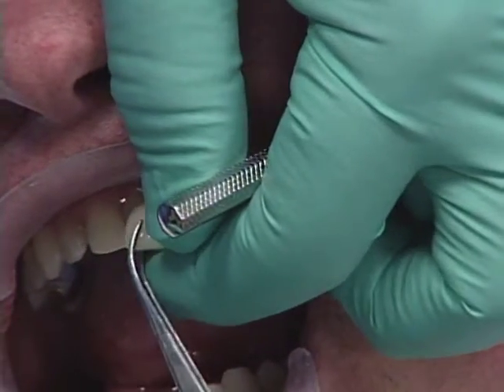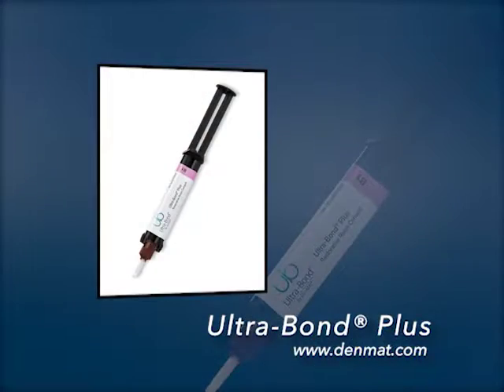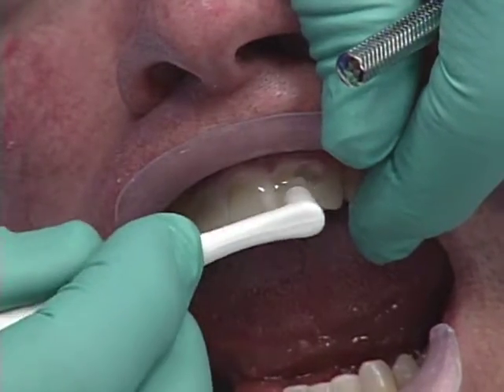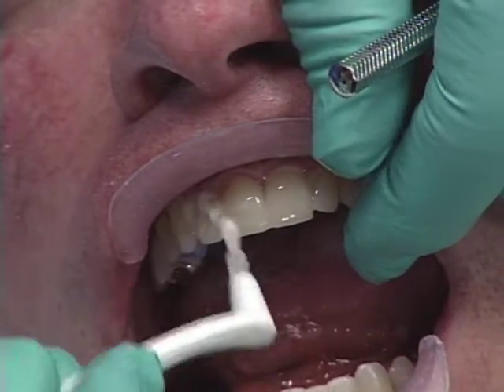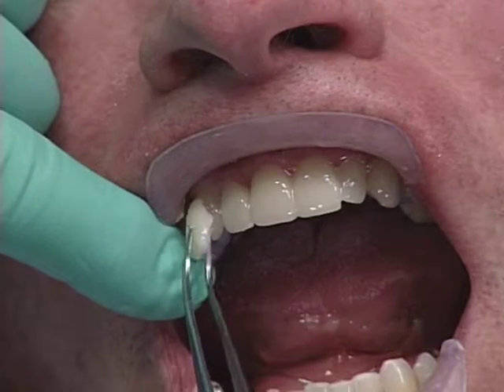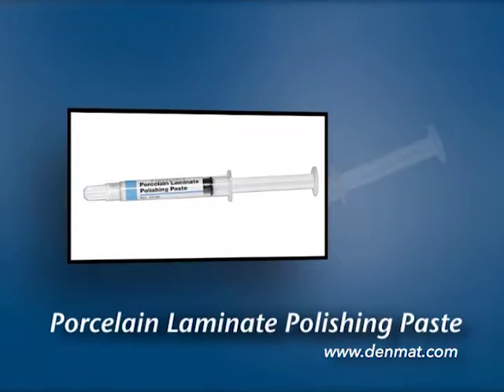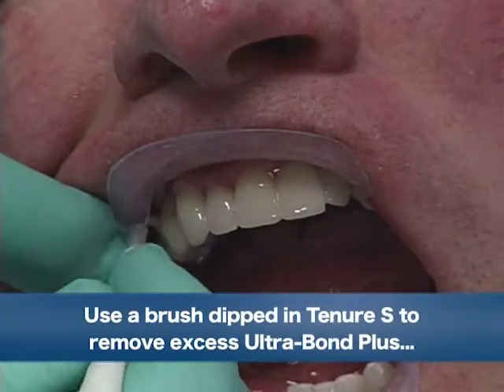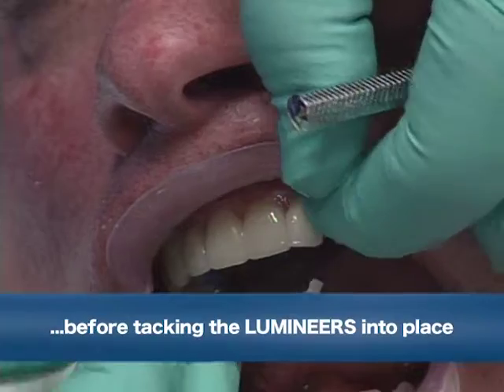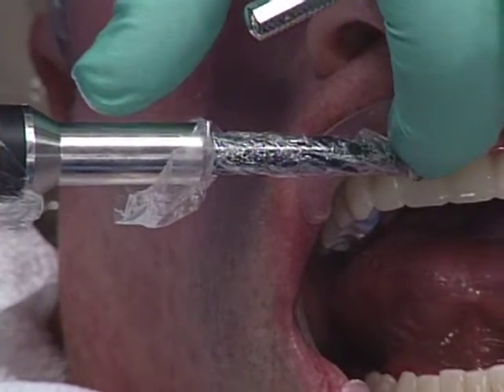Placing the left central and right central. We never use pumice — we always use porcelain polishing paste, because it has an enzyme in there to get rid of the plaque on the teeth. Plaque is like grease; it's an organic material. I'm going to spot cure each tooth that has a Lumineer and you'll see a little excess coming out, and that'll prevent these from slipping down.